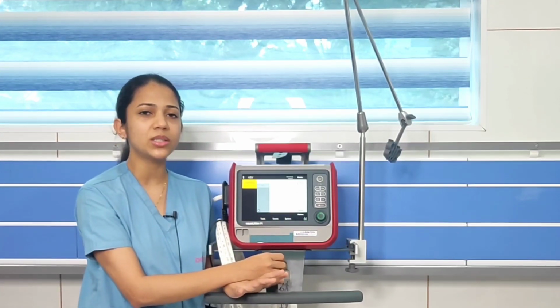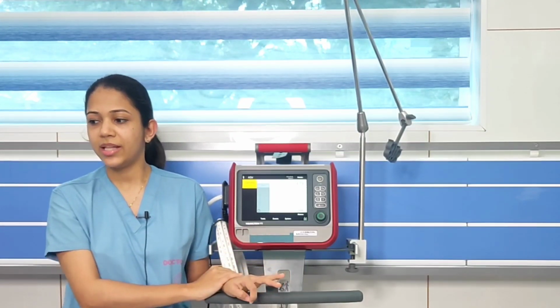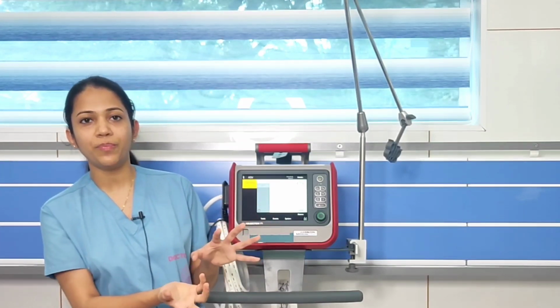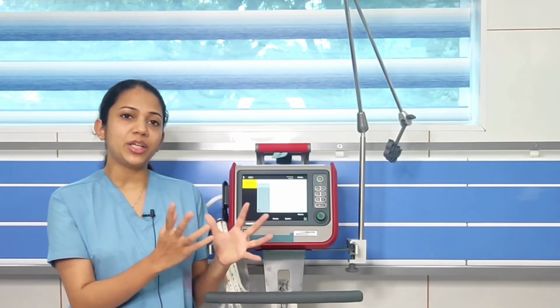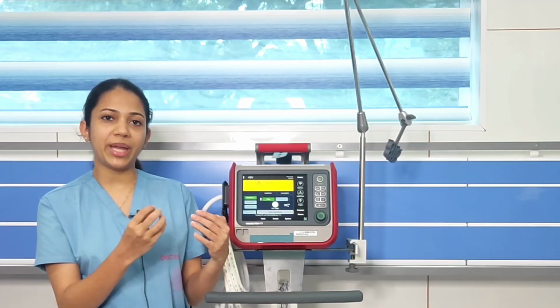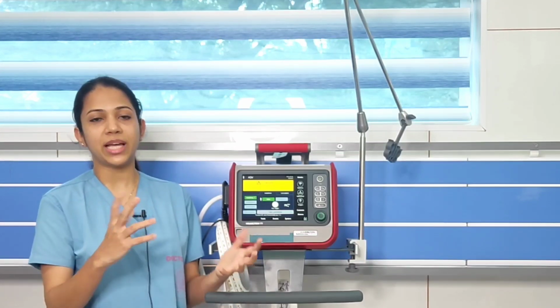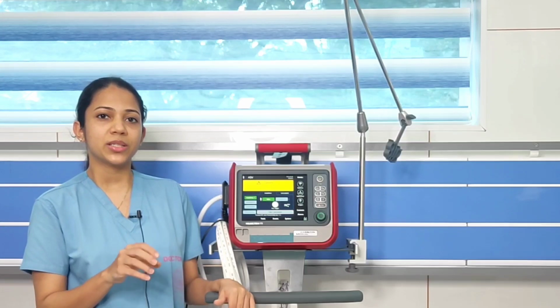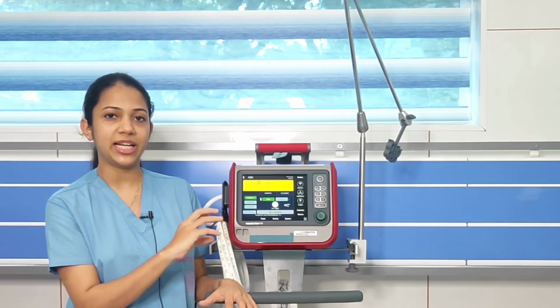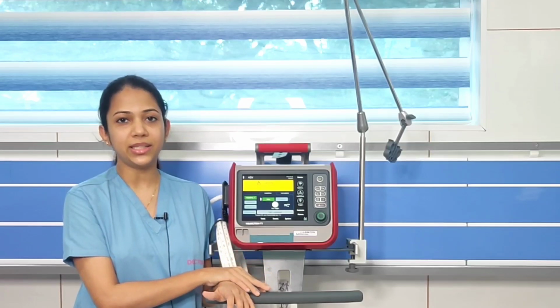So how does the ventilator sense that? Usually there is a continuous flow in the ventilator. There is a delivered flow and a return flow, and usually the return flow and delivered flow are equal. But if the patient is triggering for a breath, the delivered flow will be more than the return flow. That means the return flow will be reduced. That change in flow is sensed by the ventilator, and the ventilator will trigger the breath. So that is how we set the trigger.